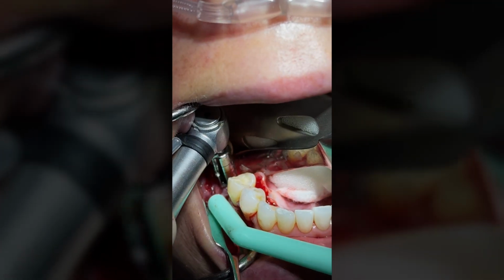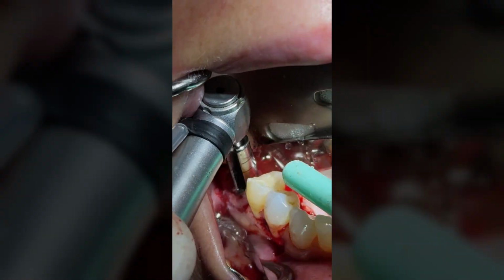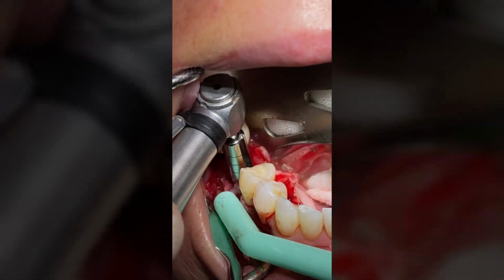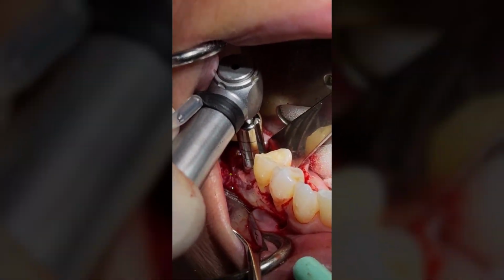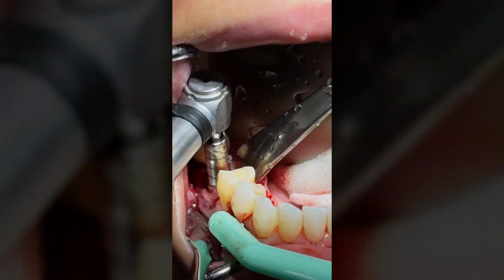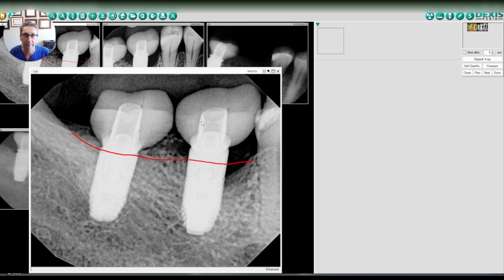When you get to that part, it's easy to remove. The most common mistake clinicians make is that they don't remove the bone properly. That's why they can't get the implant out, or if they do, it may come out with tons of bone. What we want is atraumatic explantation. It means we only want to remove the implant and leave the bone there. We need this bone for implant placement, and we need this bone for bone regeneration. So that's the important part, to be atraumatic.